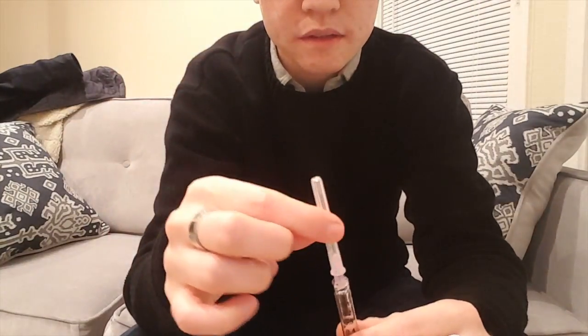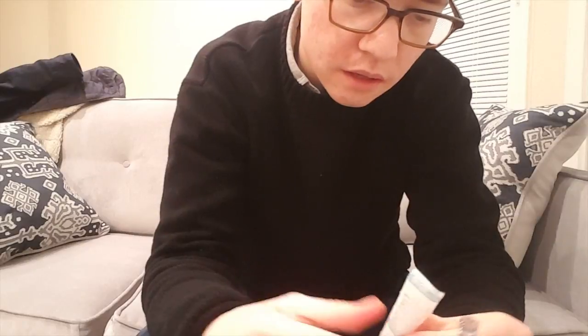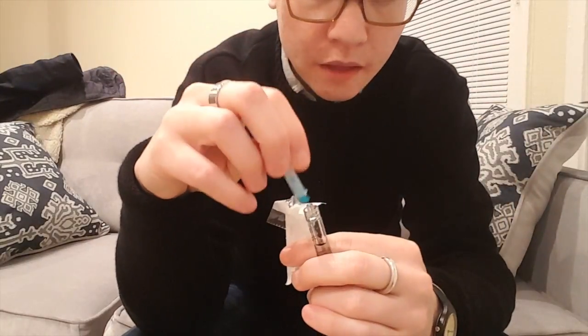Just going to cap this so that I don't hurt myself. Untwist it. Drop it into my needle thing. Then I'm going to put on a new needle. This is the needle I'm going to shoot with. I have to put it on so that this doesn't spill out of the top here.